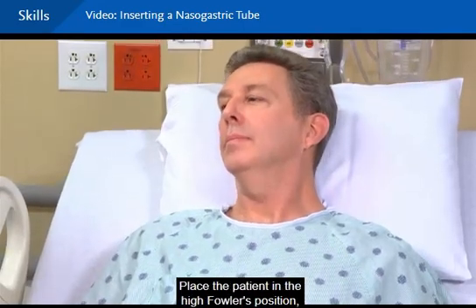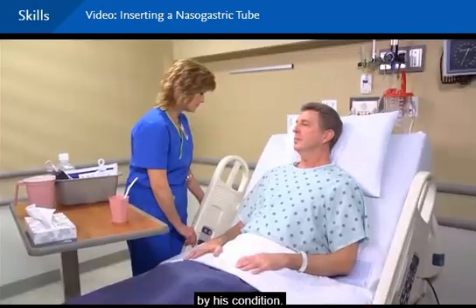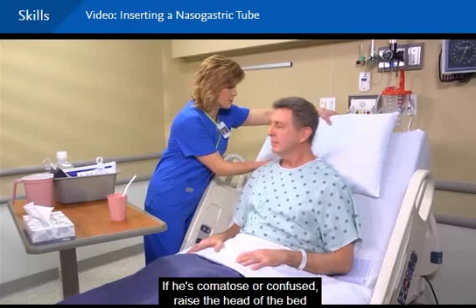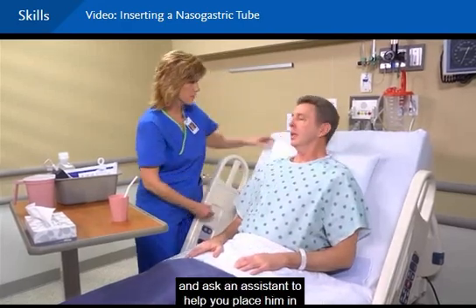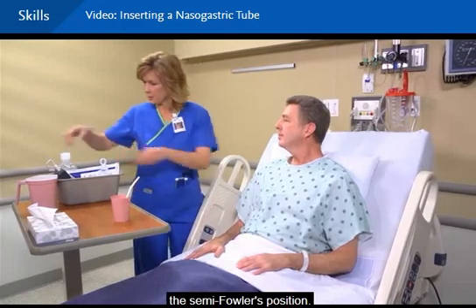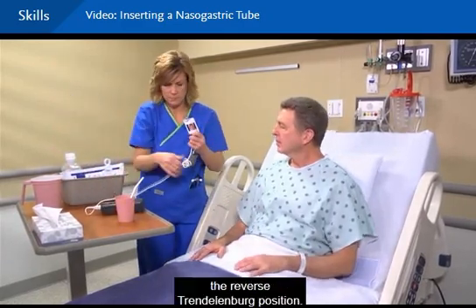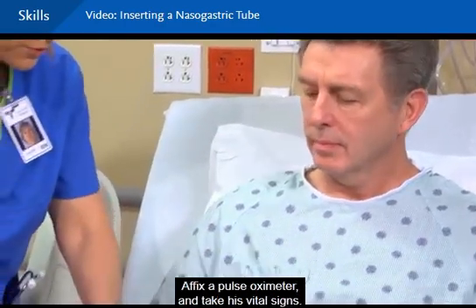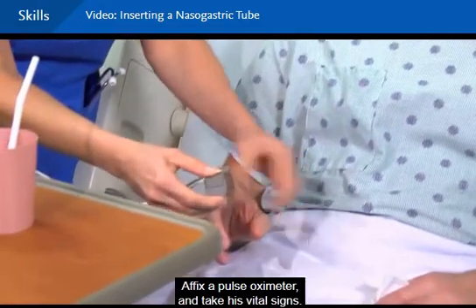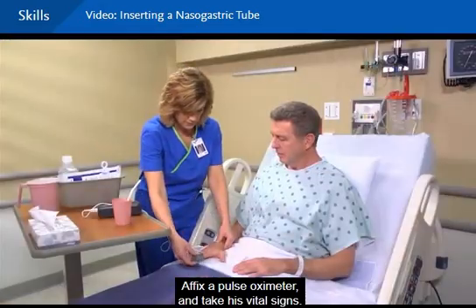Place the patient in the high Fowler's position unless doing so is contraindicated by his condition. If he's comatose or confused, raise the head of the bed and ask an assistant to help you place him in the semi-Fowler's position. If he must remain supine, place him in the reverse Trendelenburg position. Affix a pulse oximeter and take his vital signs. Rest your hand down. All right, thank you.